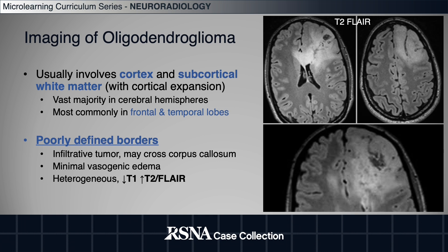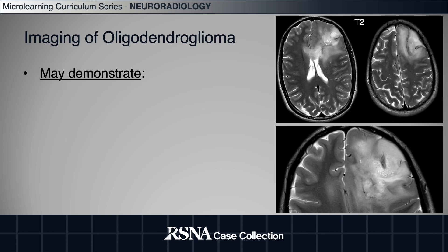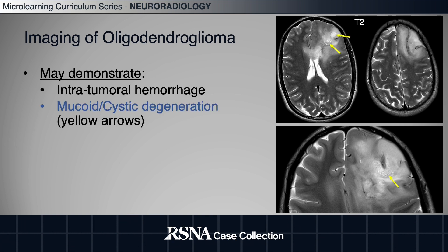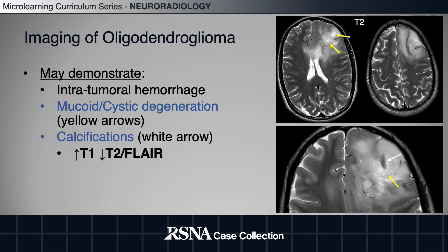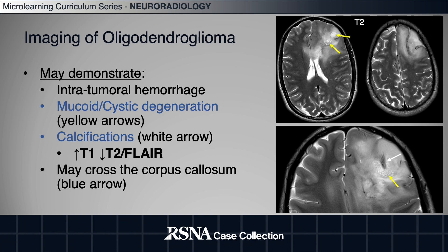They're usually heterogeneous, but generally T2 hyperintense and T1 hypointense. Tumor heterogeneity can include intratumoral hemorrhage, mucoid degeneration as seen in these small cystic T2 hyperintense foci, and they often demonstrate calcifications.